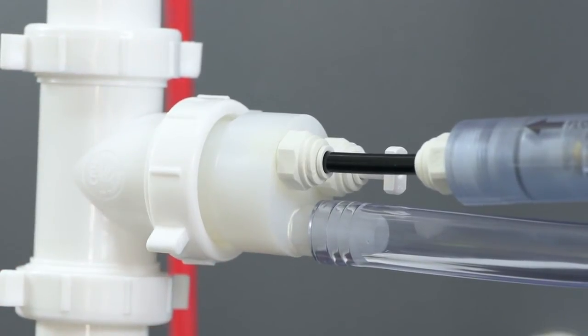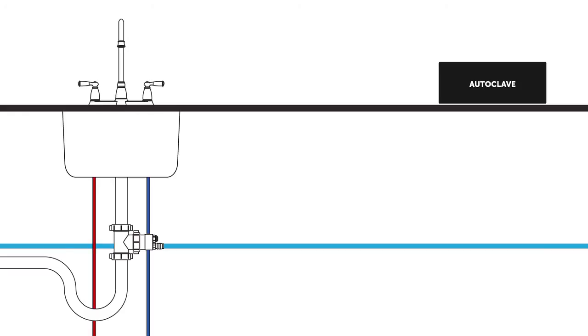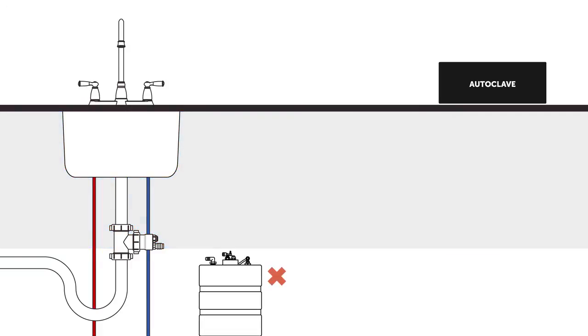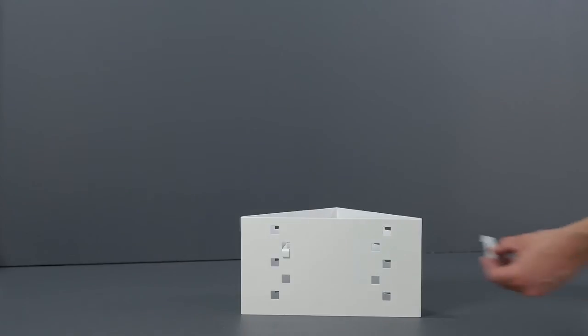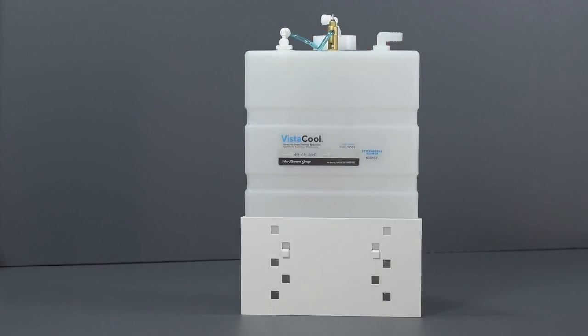Now connect one end of the ½ inch clear PVC tubing to the elbow hose barb on the tank and the other end to the straight ½ inch hose barb on the drain line adapter. Make sure the tubing is firmly engaged over the barbs. If in doubt, use appropriately sized hose clamps. The VistaCool system should be set on a hard, level surface and installed so that the top of the water tank is above the coolant overflow fitting on the drain adapter assembly and below the autoclave outlet. If the tank is below the level of the coolant overflow fitting, the system may not operate properly. Installing a tank at the wrong height may create resistance for proper water flow since the system is designed to take advantage of gravity flow. Adjustable tank stands for installing the VistaCool at the correct height are available as accessories when needed, and raise the tank height between ½ to 5 inches in ½ inch increments.